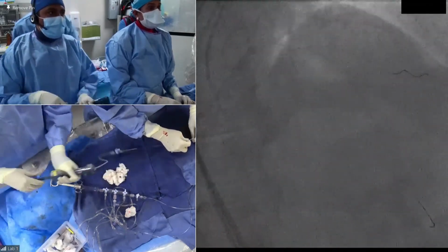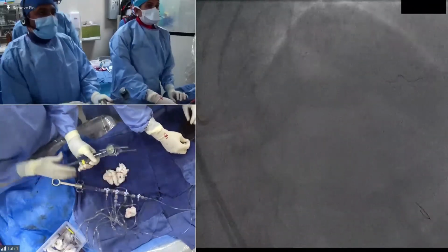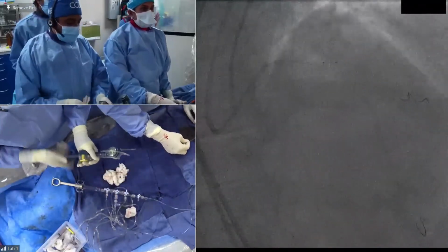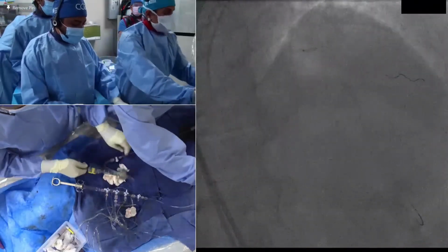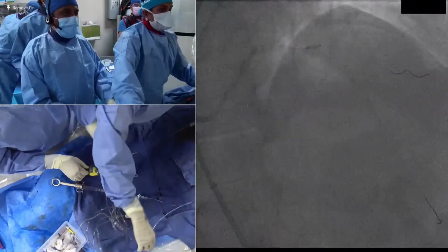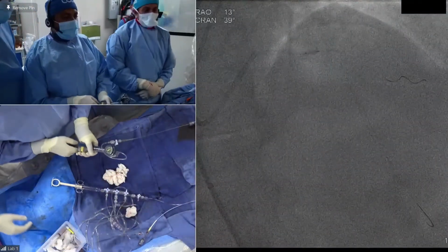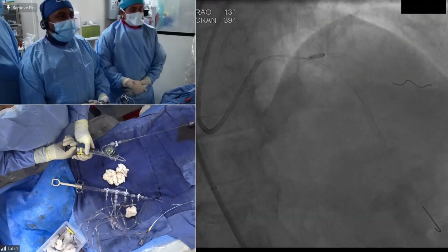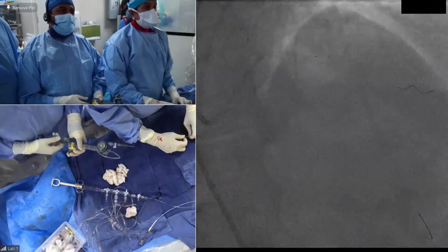Okay, here. Delivery, very good. Despite the plaque shift that I was a little concerned about, no issues. All right, how high do we want to go with this balloon? 10? 6? Yeah, we went to 14. Down. No, let's go 10 first and we'll see about that.